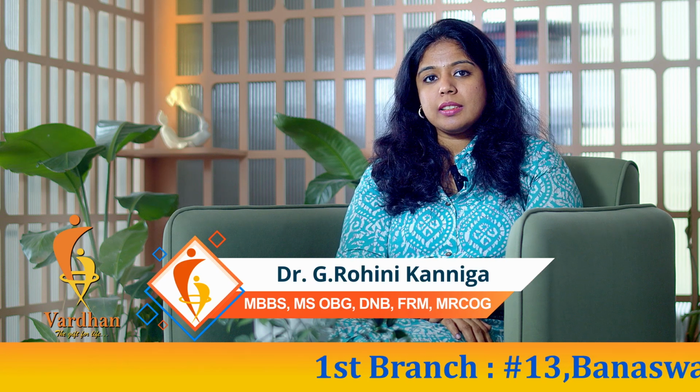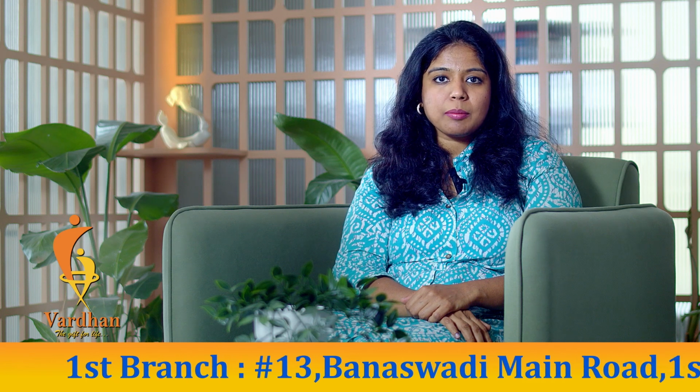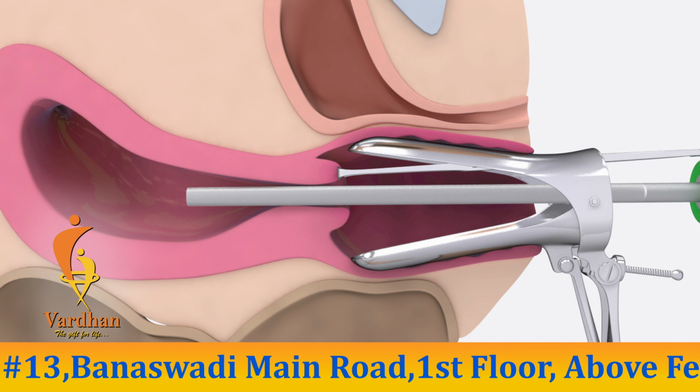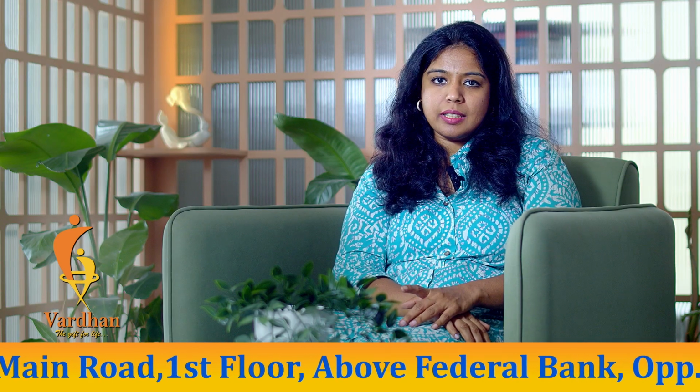So basically what is done in this procedure is that we check the inside of the uterus to see if there is any abnormality in the shape of the uterus or any abnormality in the lining. So what are the indications for which it is done?